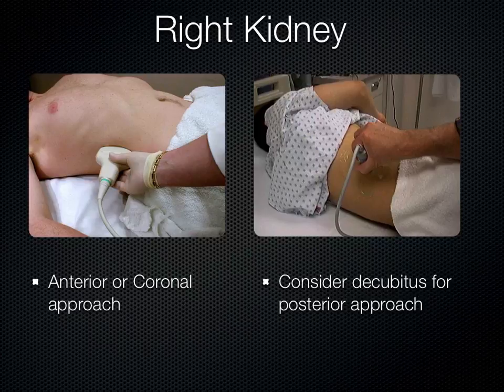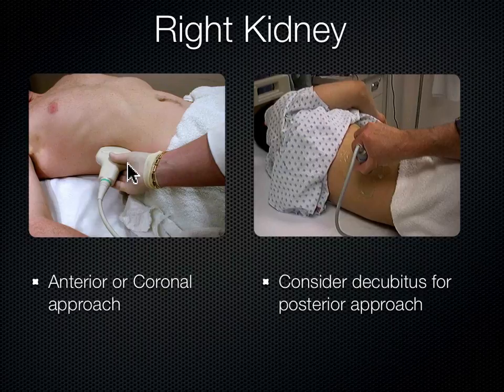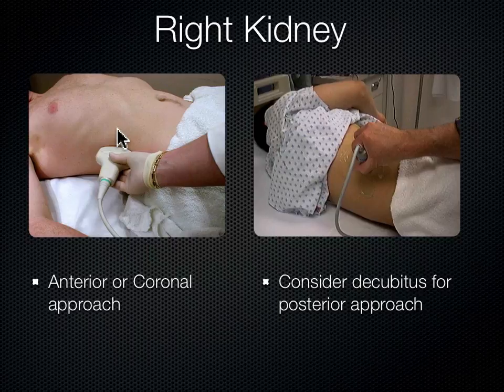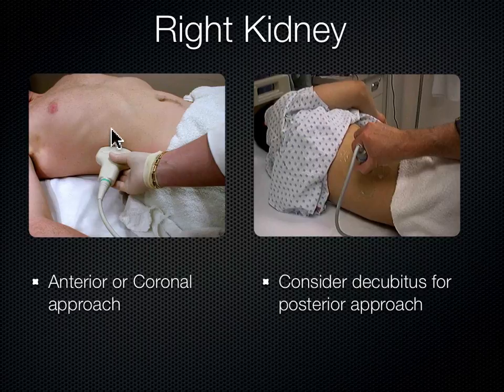For the right kidney, there are a couple of approaches. You can come from the side — coronal — and often get good views right away. Occasionally you drag the probe anteriorly, but since the kidneys are still a posterior structure, you compensate by fanning the probe posteriorly — tilting the cable toward the ceiling so sound shoots more posteriorly. Using the liver or spleen as your window via this anterior approach is often better than even a coronal view, though every patient is different.